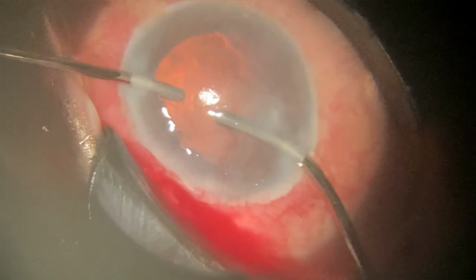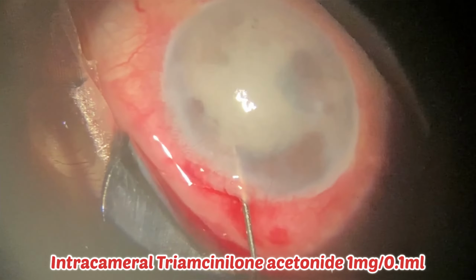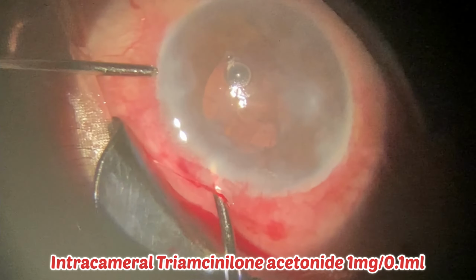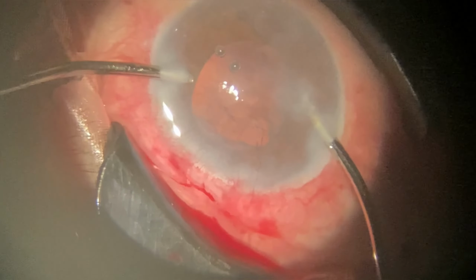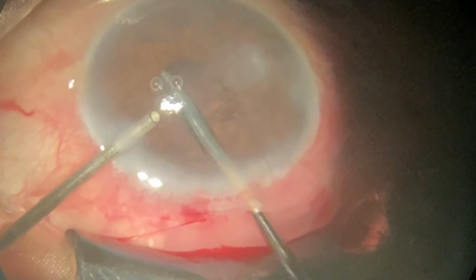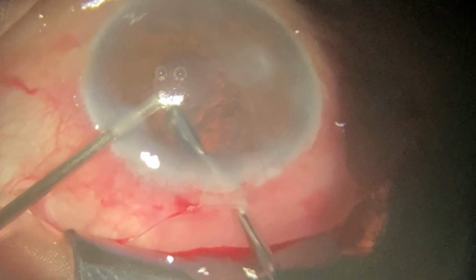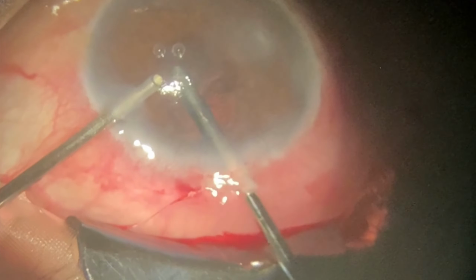Now I am removing the viscoelastic with the help of the irrigation aspiration cannula. I have noted some vitreous at the superior end of the pupil, so I am using anterior vitrectomy to remove this vitreous so that there should not be any traction on the vitreous.